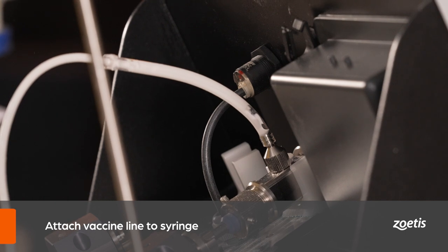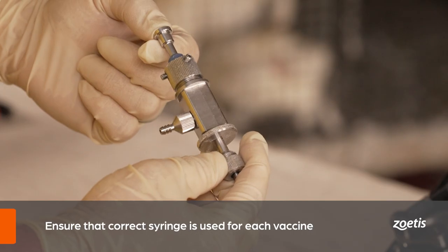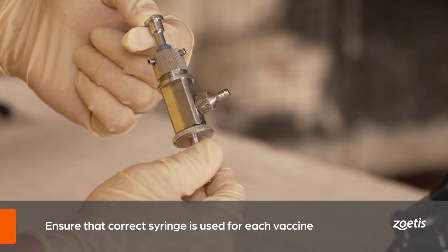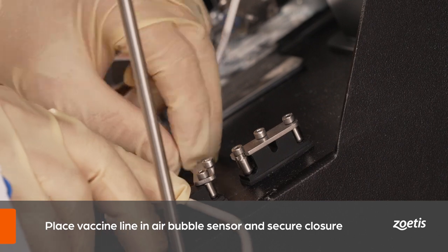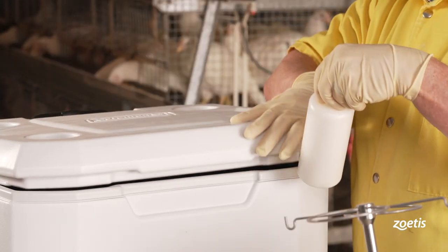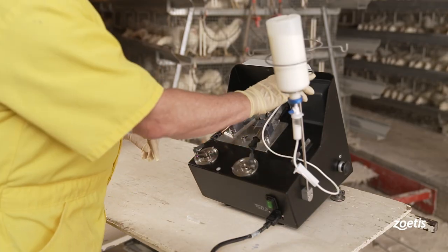You can gently squeeze the bottle to increase the vaccine flow rate during the priming process. Once the vaccine has traveled near the end of the drip tube, attach the line to the syringe. The syringe is designed to deliver a fixed volume of vaccine — pay careful attention to the label to ensure the correct syringe is used for each vaccine. After the drip tube is attached to the syringe, place the line through the air bubble sensor and secure the metal closure.